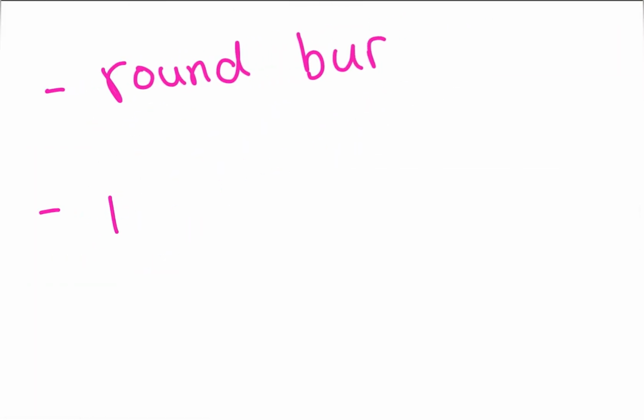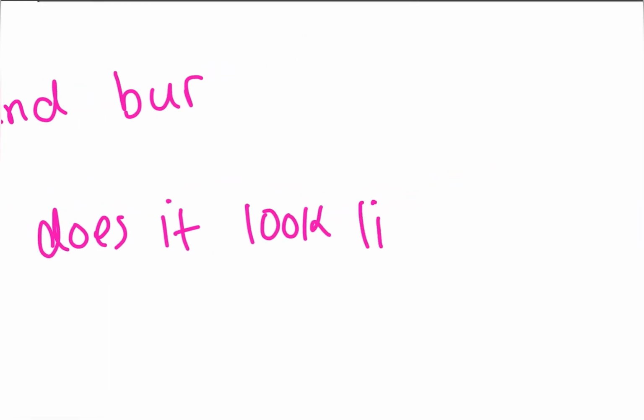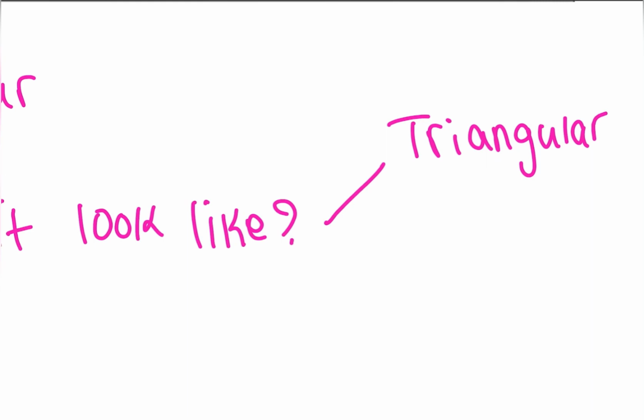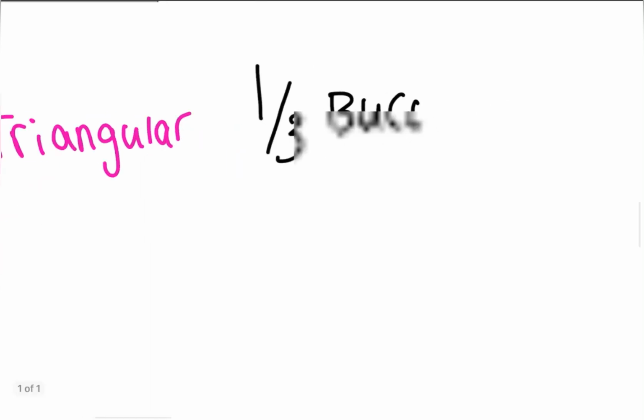Let me write it like this. Usually it is triangular, okay? It is usually 1/3 of the buccolingual width.